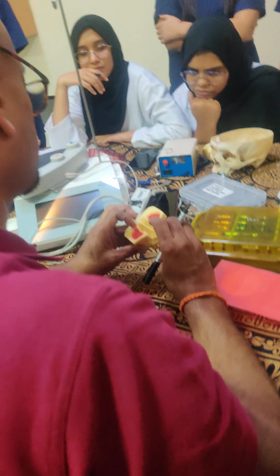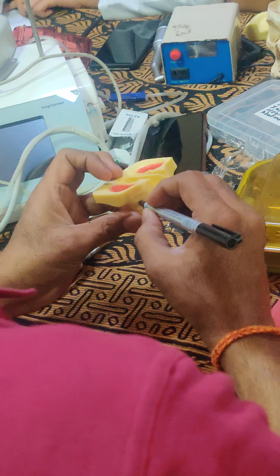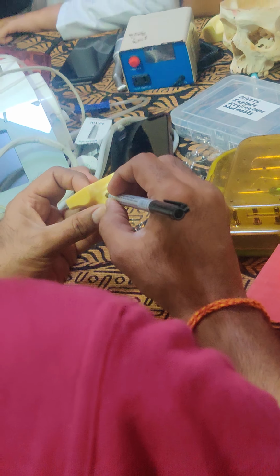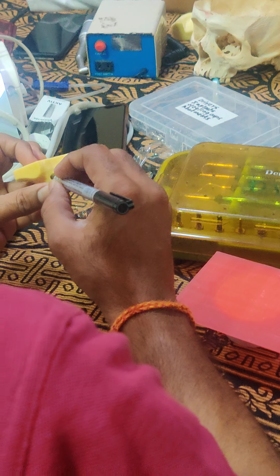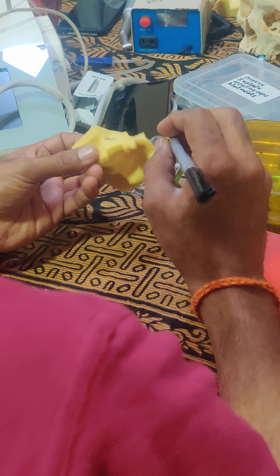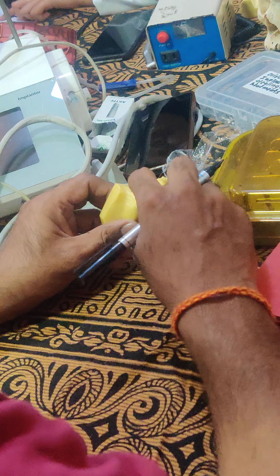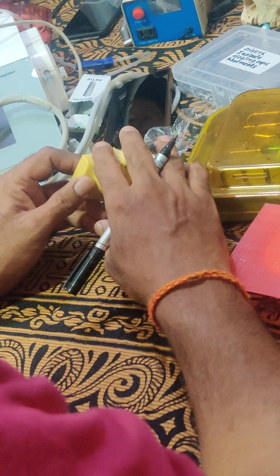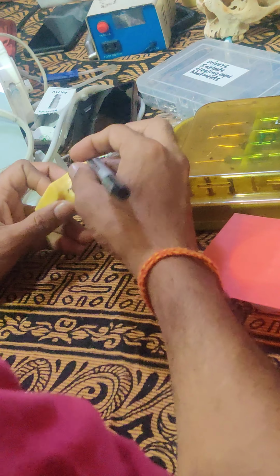Okay. First we are going to mark the floor of the sinus. Okay, I have marked the floor of the sinus. Okay, the height available, let us assume, is 4 mm. Here it is more actually. In this case, we don't need sinus lift at all. Okay, but let us assume the height is less. We want to do sinus lift.